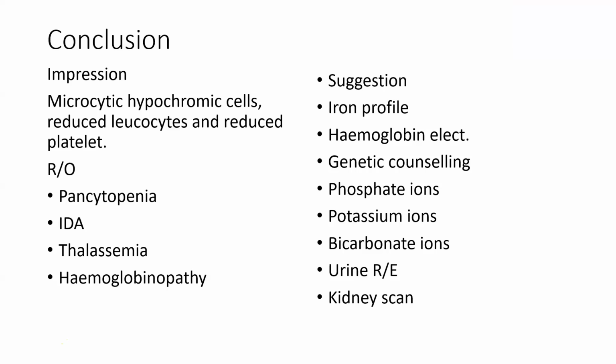I just want to say a little bit. For me, it is a very, very good exercise that we have been through this evening. The little that I want to add is that we must always, like he said, review a film. Upon reviewing a film, it will narrow the field for us to make suggestions.